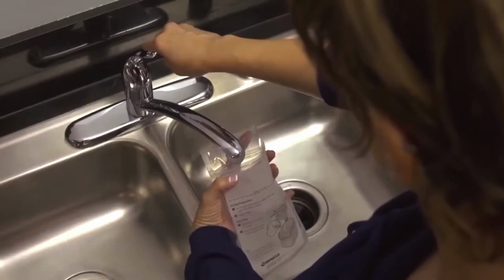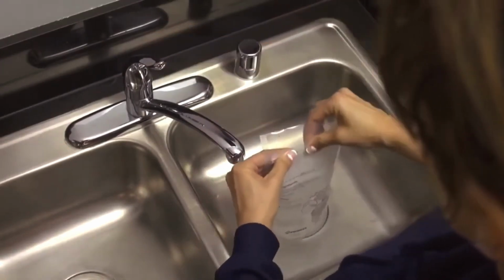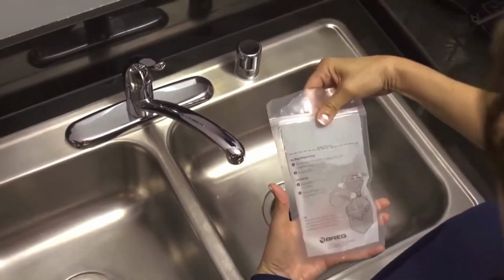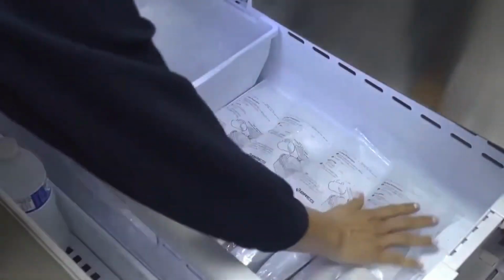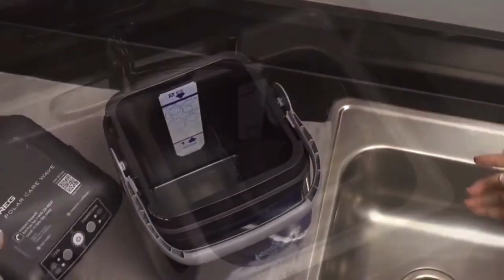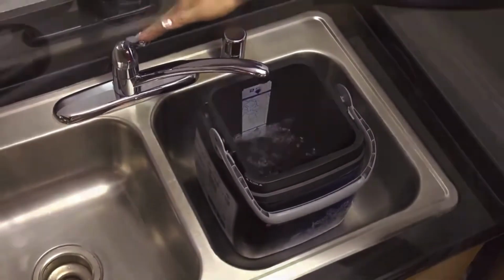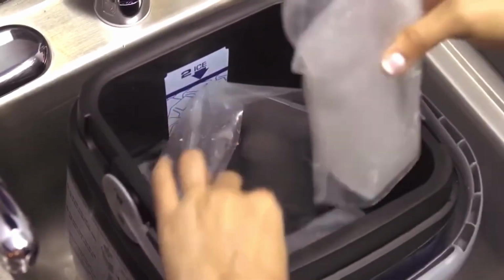To use the Wave product with BREG ice bags instead of cubed ice, fill 4 BREG ice bags with water to the fill line and freeze them in your freezer. Unlock the handle by rotating the handle to the front of the container. Remove the lid and fill the container with water to the water fill line, then put the 4 BREG ice bags into the corners of the container.